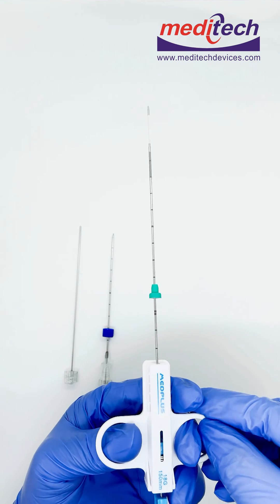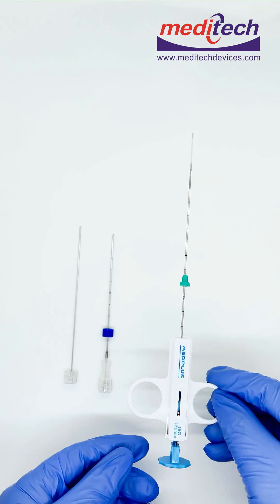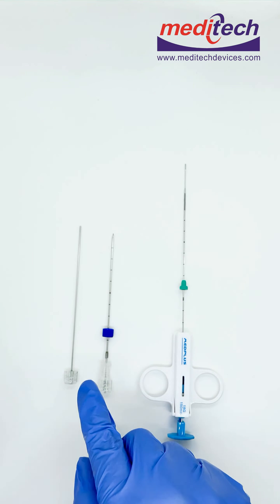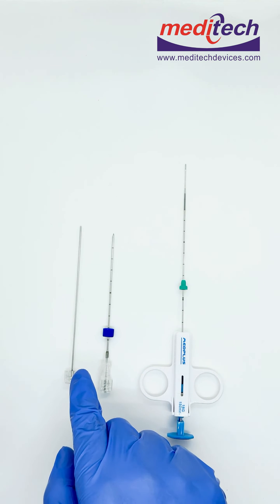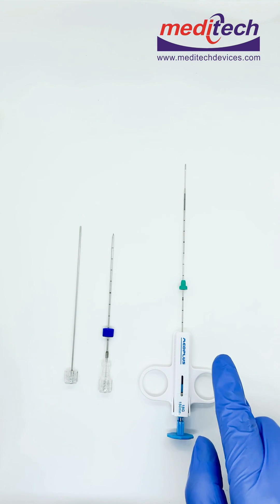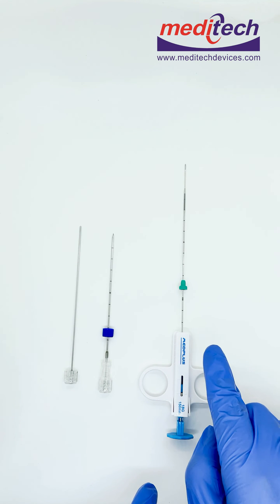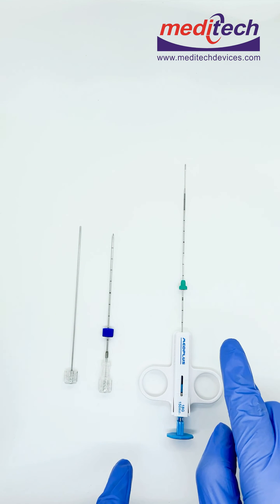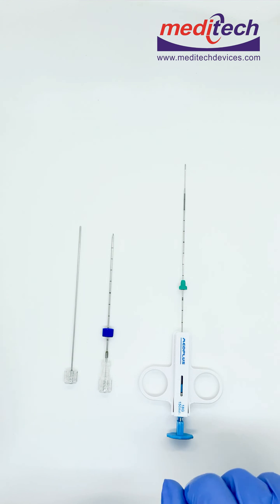Once you get the core, you can send it for pathology. It comes with compatible coaxial needles. The semi-automatic biopsy instrument comes in 14 gauge, 16 gauge, 18 gauge, and 20 gauge with various lengths. For more details, kindly visit our website www.meditechdevices.com.